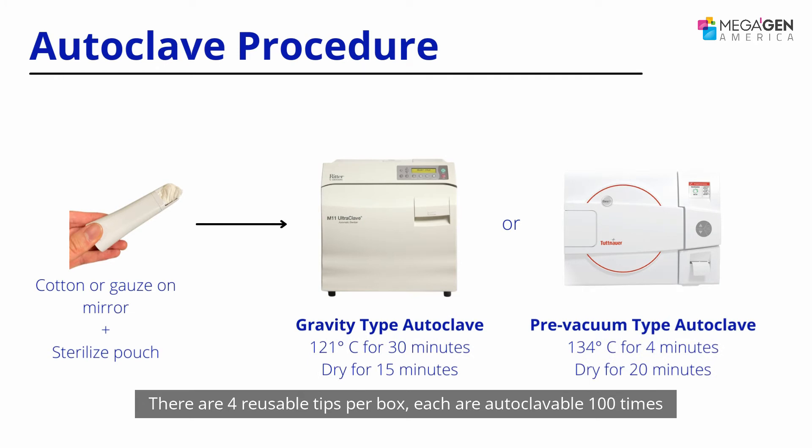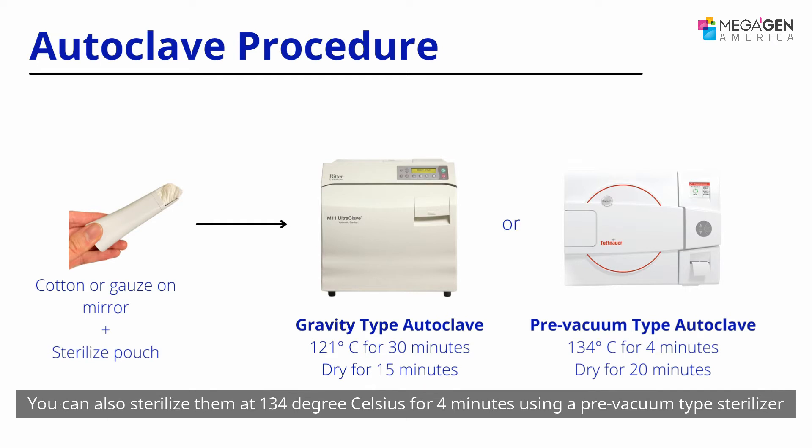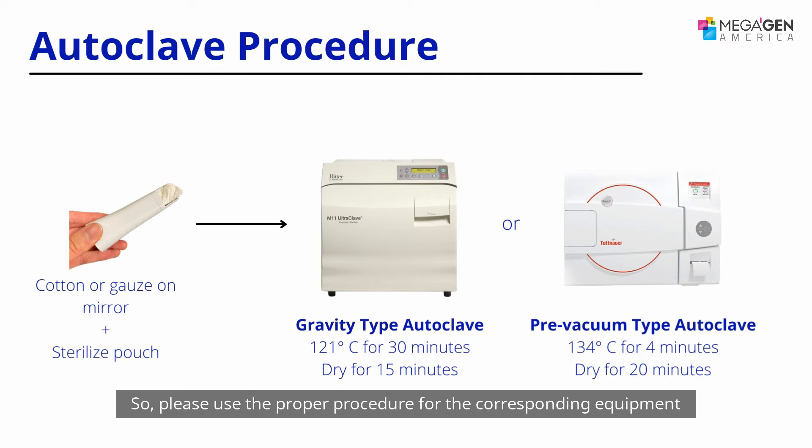There are four reusable tips per box. Each are autoclavable 100 times at 121 degrees Celsius for 30 minutes using a gravity type steam sterilizer. You can also sterilize them at 134 degrees Celsius for four minutes using a pre-vacuum type sterilizer. When you autoclave your tips, placing a cotton ball or gauze on the mirror can prolong its use, so please use the proper procedure for the corresponding equipment.